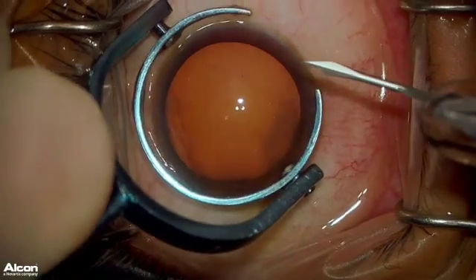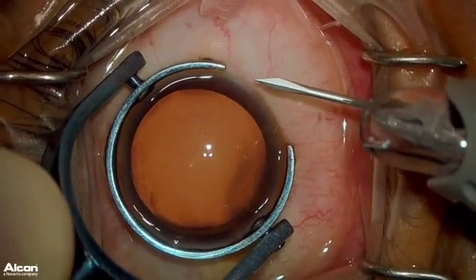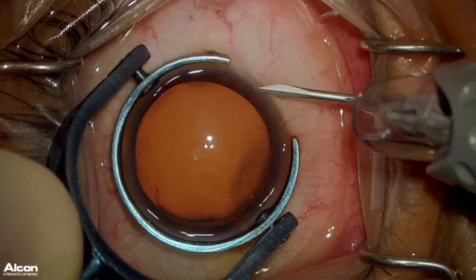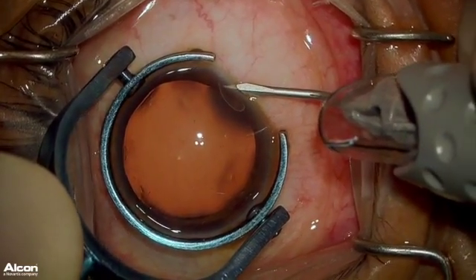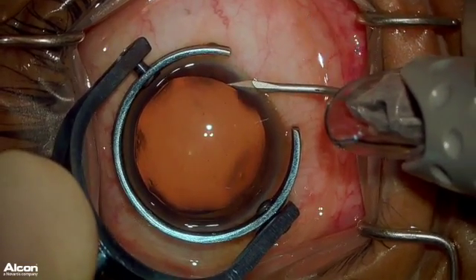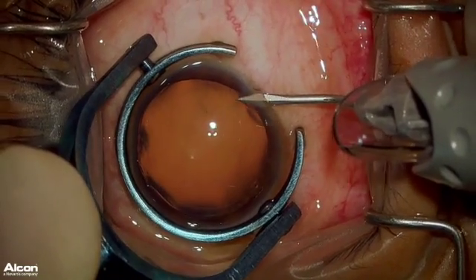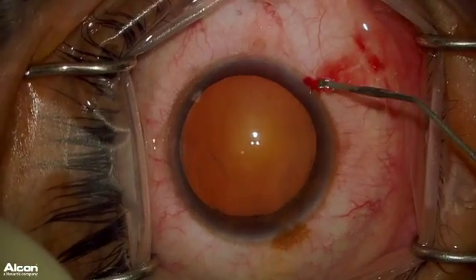This is a right eye patient, and for every right eye patient, I start off my surgery by making a paracentesis around the 4 o'clock meridian, directing my paracentesis toward the 3 o'clock meridian. I then enlarge my paracentesis ever so slightly. This paracentesis architecture will enable me to easily access the ICL footplates with my ICL manipulator later on when I dial the ICL into the sulcus.